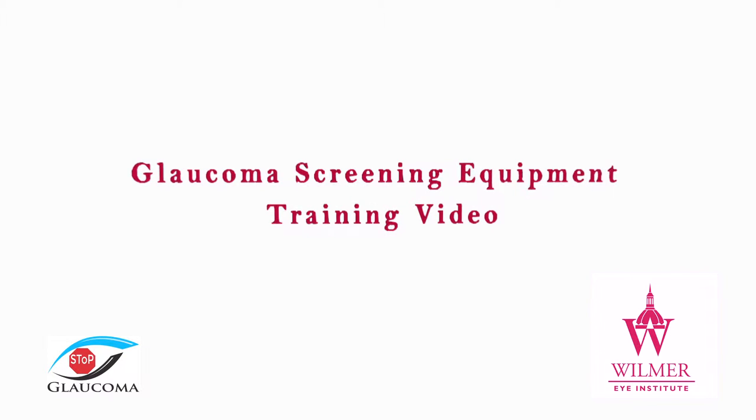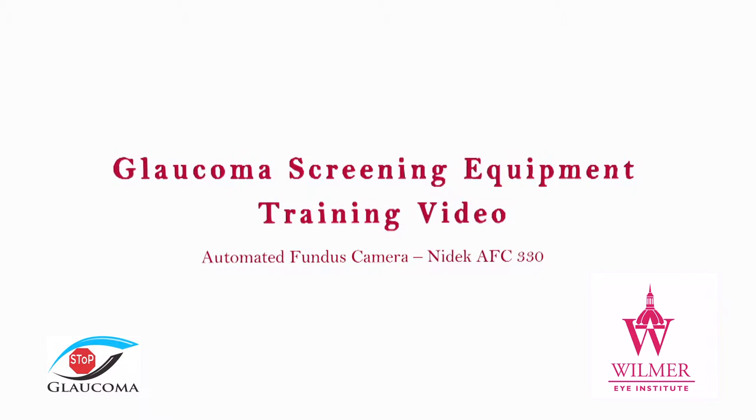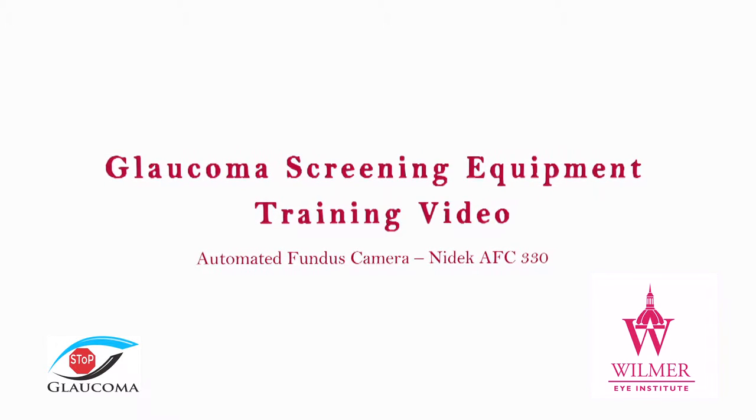This is a training video of the non-mediatic auto fundus camera for the Baltimore City Glaucoma Screening Program, organized by the Wilmer Eye Institute of Johns Hopkins University.